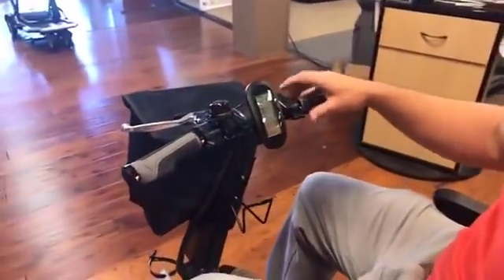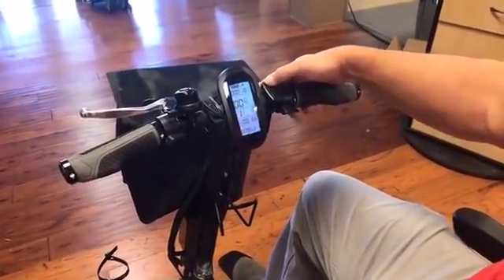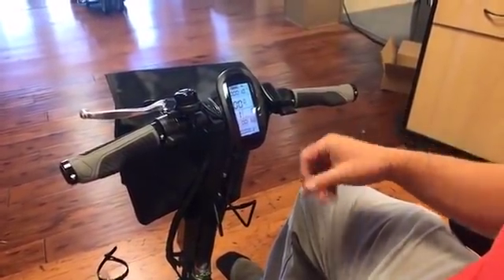Right here, you'll see I can hold this top button and the LED screen lights up. That also turns on the front light here and the rear light in the back.